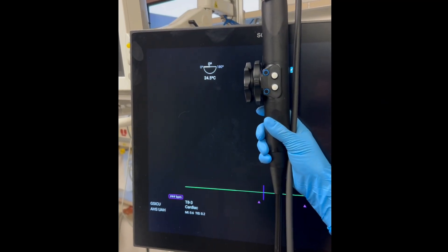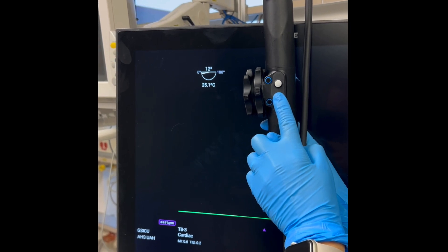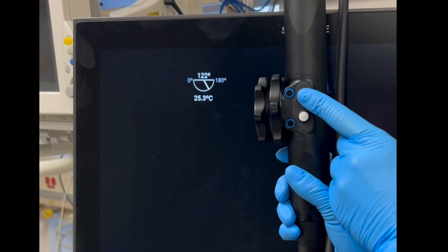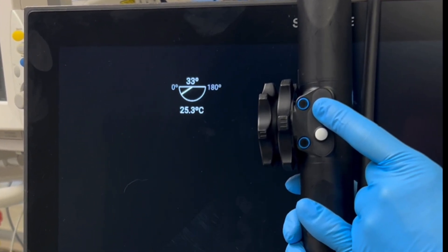The buttons on the control handle adjust the angle of the ultrasound crystals within the probe tip, allowing you to change the imaging plane. These adjustments are essential for obtaining different views, such as transitioning from a four-chamber view to a long axis view. Each movement should be small and deliberate to maintain image clarity.